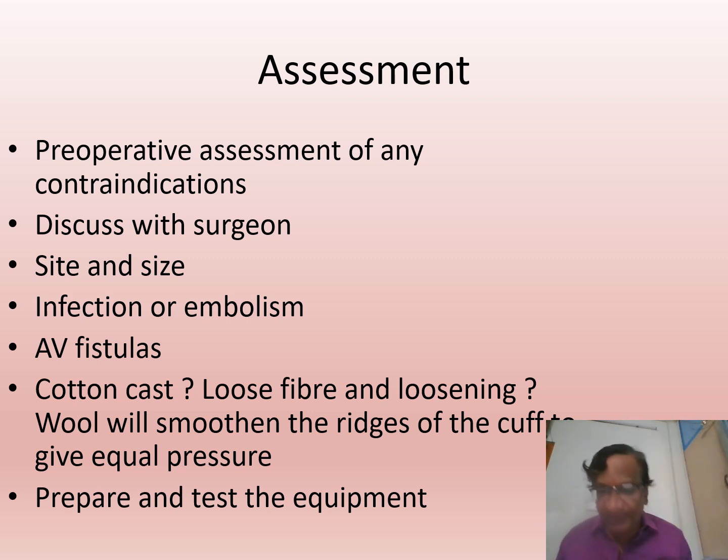Prepare and test the equipment prior, because it may deflate at the most crucial time. So check it again before you administer it to the patient.